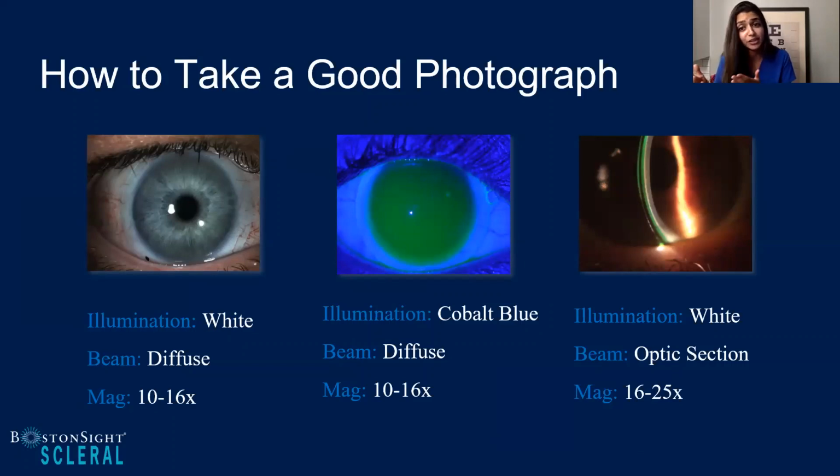If you're looking at your corneal vault, you're going to look at a very high mag, increased illumination, a really tight optic section, using your filter to look overall and assessing your fluorescein pattern, and then using nice quiet diffuse light on lower magnifications to look at that overall picture of the scleral landing zones as well. So practice makes perfect. Take those photos and you'll learn and get better. We're not photographers by trade, but we know for a fact that it definitely helps us improve our skills the more we capture these images.